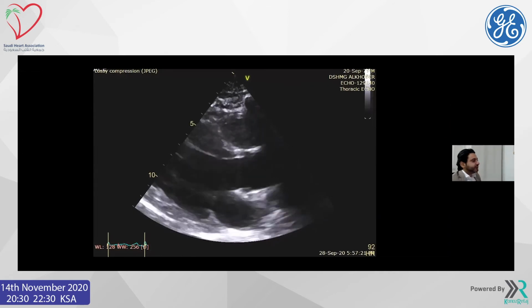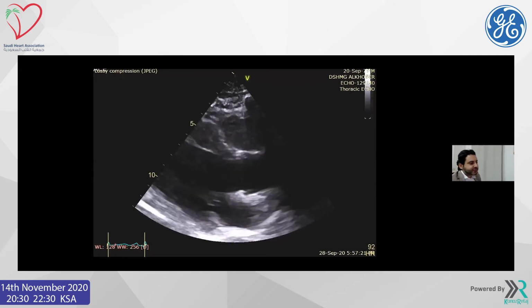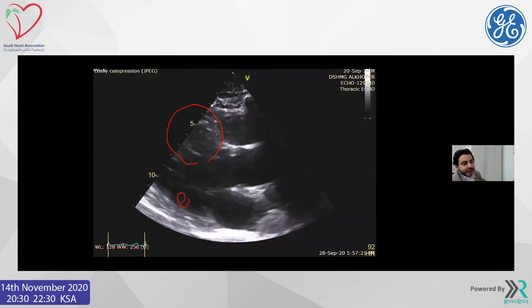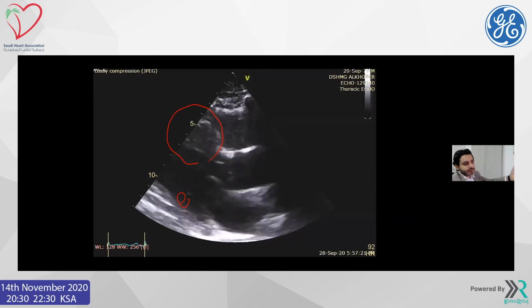His complaint is really not very specific. Some shortness of breath, maybe chest pain. But look at this septum. Really, this septum is huge compared to the small posterior wall here. I would call it immediately asymmetrical septal hypertrophy and maybe start with HCM from there.